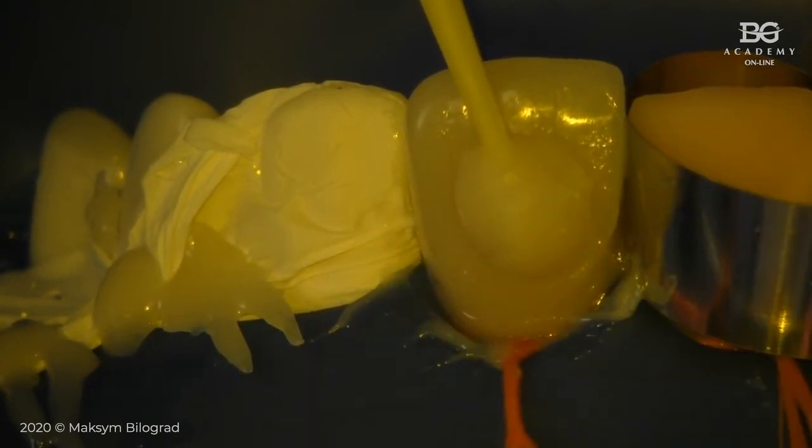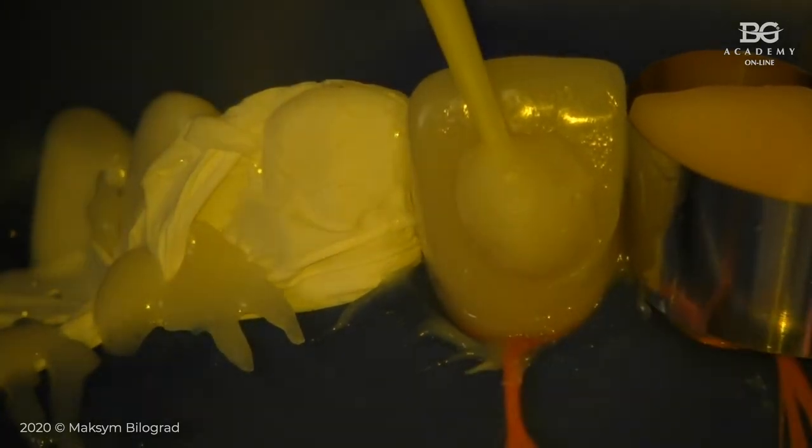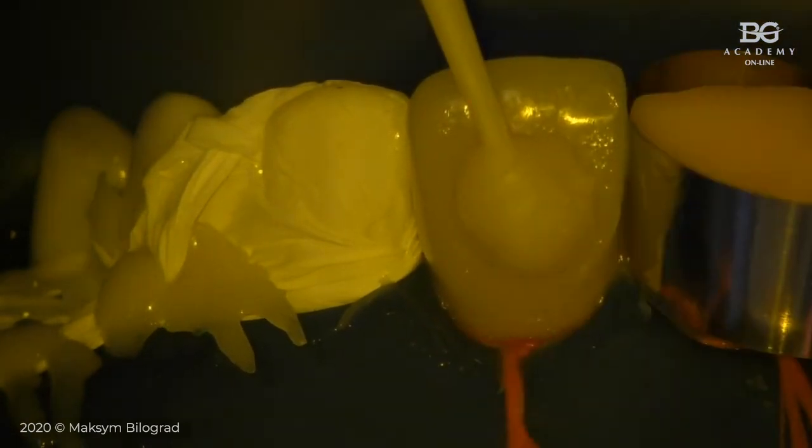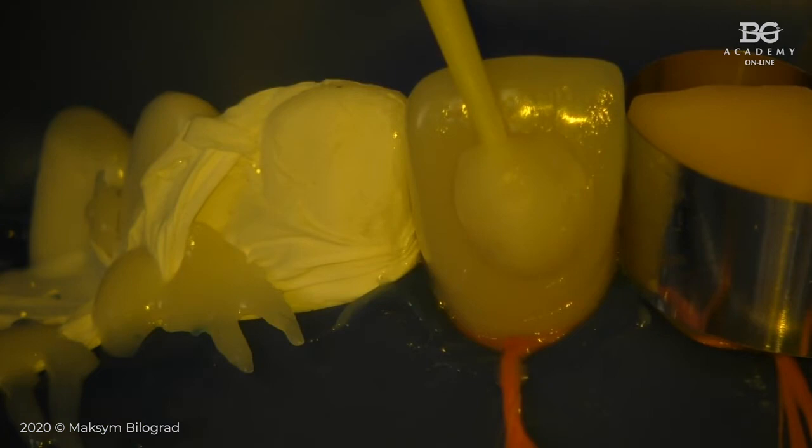I really like to work with light curable cements, because if I use light curable cements, I'm not limited in time. So I can play with the brush here as long as I want. Why it is important, you will see later on. So I'm just taking out the major excess with a brush.